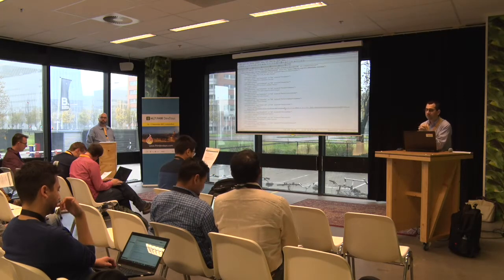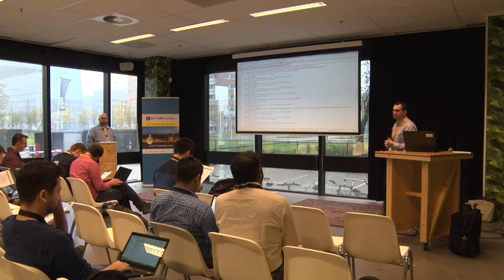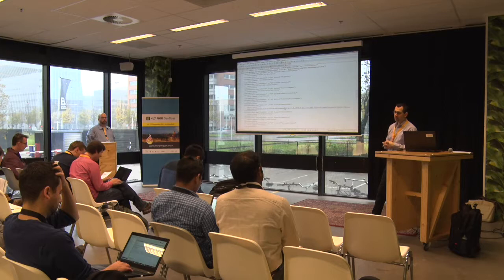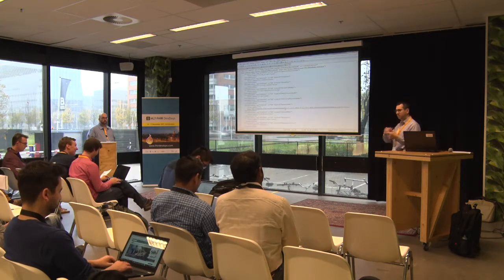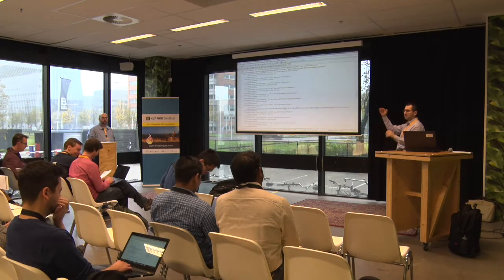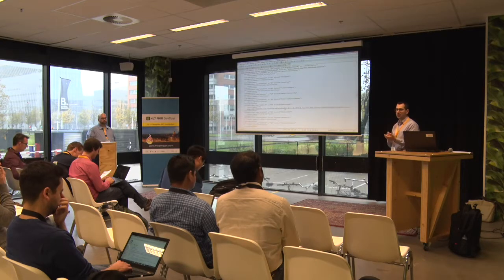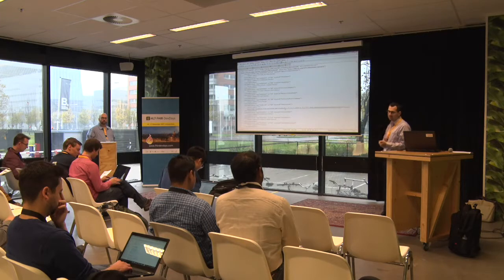So if I am using DICOM Web, then I have to go through a layer by layer structure. Like when I am using the traditional DICOM, then I get the DICOM file where I have all the tags with the complete information. Well, it depends on which information you have. So if you have the identifier for the study and object you want, you could just go and retrieve it right away. In this case, we're going at it from, let's say, someone who's building a little app. So maybe I'm building an app where I want to be able to search on my phone. If you needed to start searching from a human discoverable way, you probably want to start at the patient level, right?